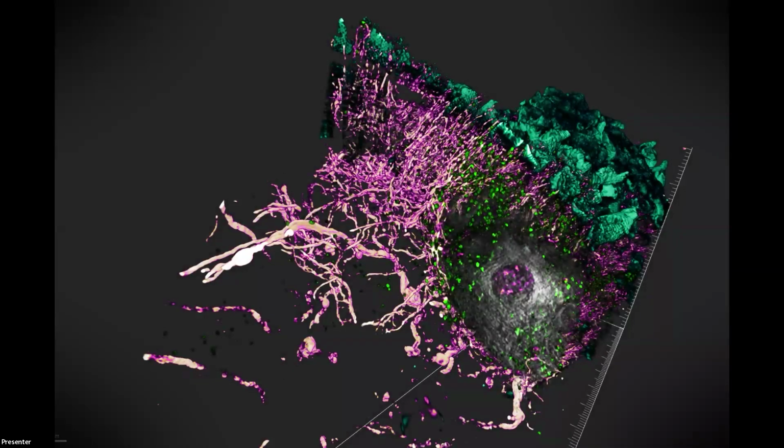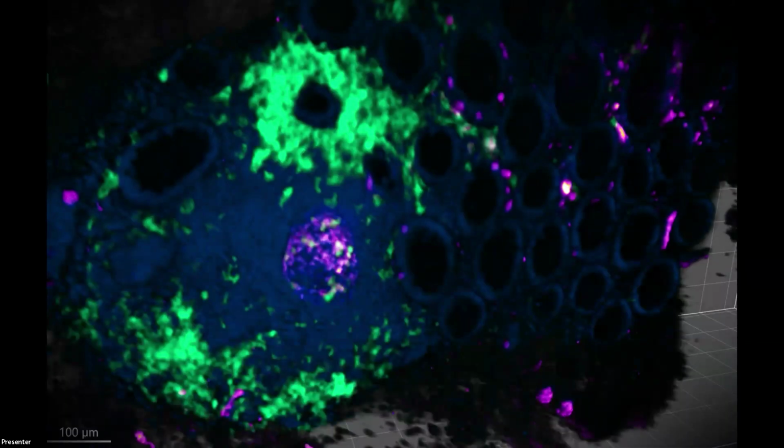It's been known that the colon contains lymphoid aggregates, which are immune cell rich, which we see very nicely with high contrast here and are easily identifiable based on DAPI alone. There is already much work being done on applying cyclic immunofluorescence on understanding the structure and the composition of these immune aggregates and how it relates to forming a protective defense system against diseases in lung and colon.